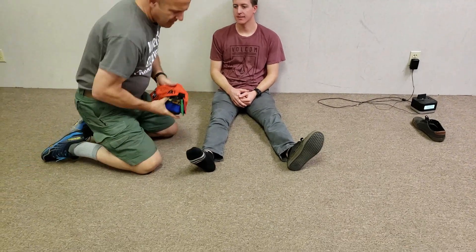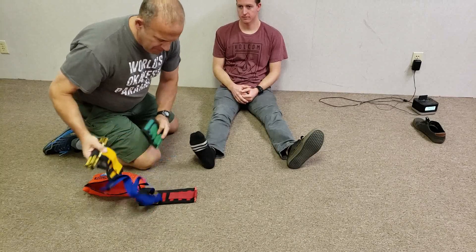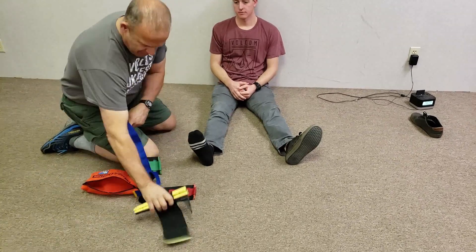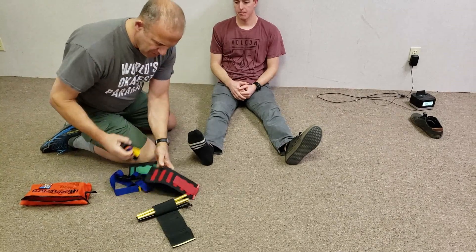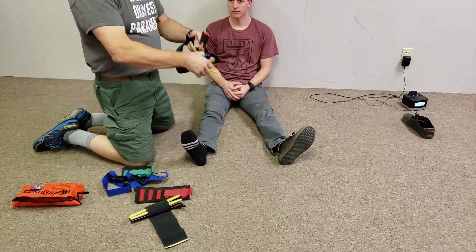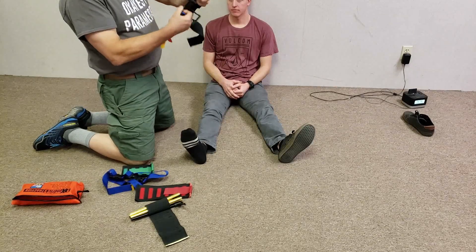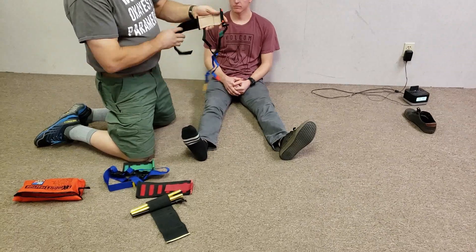Here is a demonstration on applying the Kendrick traction splint. This splint is a very nice lightweight splint and it uses segmented pull, designed for femur fractures — in particular mid-shaft femur fractures amenable to traction.